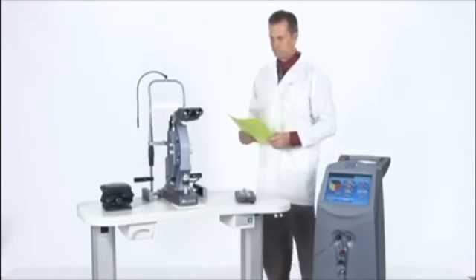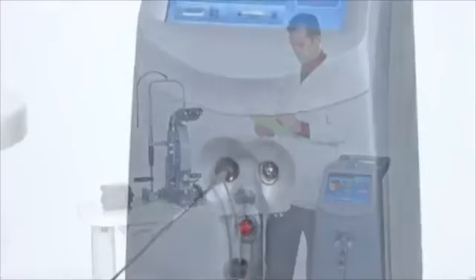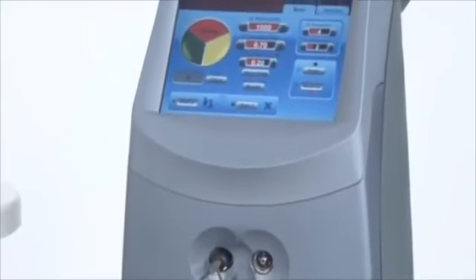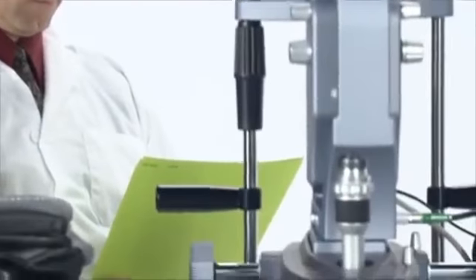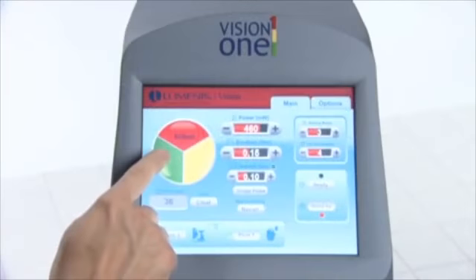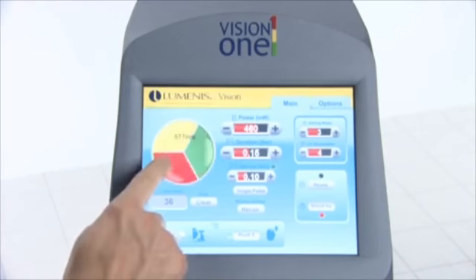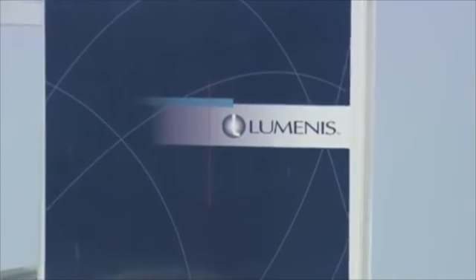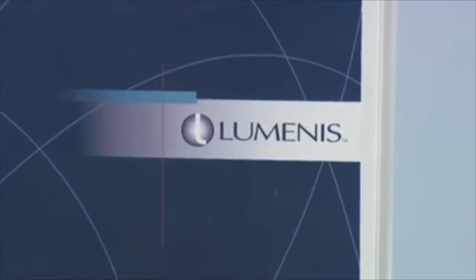This presentation will introduce you to the Lumenis Vision 1 3-color ophthalmic laser system and the various components that make up the system and their safe use and maintenance. Remember, lasers generate a highly concentrated beam of light that may cause injury if improperly used. To protect the patient and operating personnel, the entire laser and the appropriate delivery system operator manuals, including all safety regulatory sections, should be carefully read and comprehended before operation.